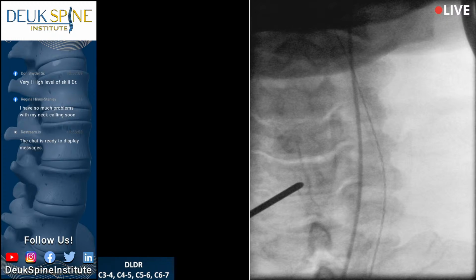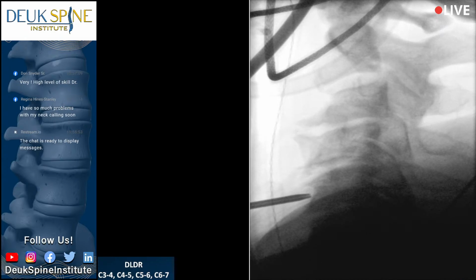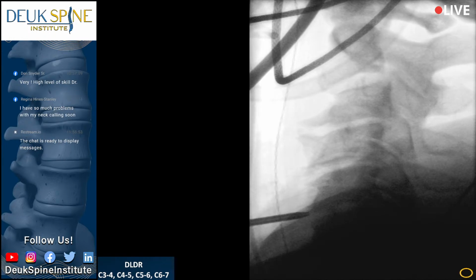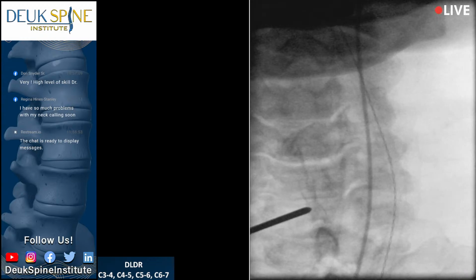I'm feeling. Shot. Halfway there. Shot. Shot. I feel like I got it. Yeah, we're there. Shot. That's beautiful. I need an AP now. Everybody stay. I need 30 seconds more. My team is doing an amazing job. This is where they get their workout. Lateral. That's perfect. Let's go lateral.